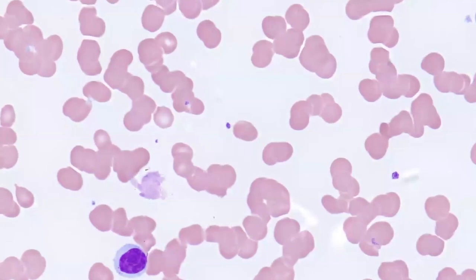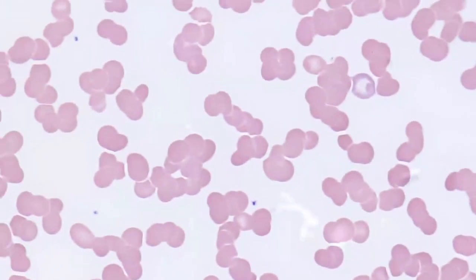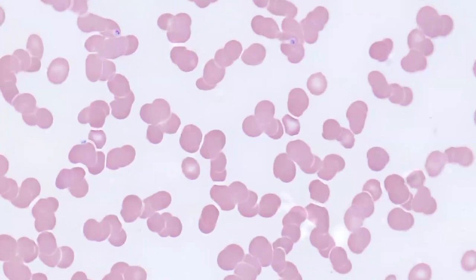And if we go on higher power, we get a better sense of what these red cells look like when they're stacked up on one another. And so these stacks of red cells or stacks of coins are referred to as rouleau. True rouleau is often associated with hyperproteinemia, primarily hyperglobulinemia and hyperfibrinogenemia. In contrast, artificial rouleau, which is typically seen in the thick area of virtually every smear, is not associated with any disease state. Hyperproteinemia can also cause a sort of blue tinged background.